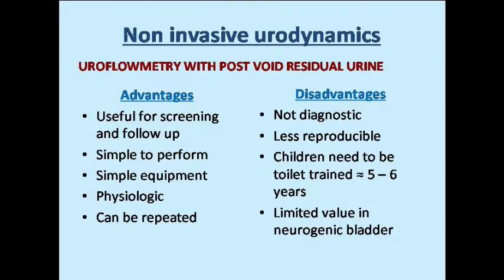At the same time, whenever it's a simple investigation, it is equal chance. There is always a chance of it being abused. And it is significantly abused in adult practice because people don't understand it. They don't even look at the volume which is voided.